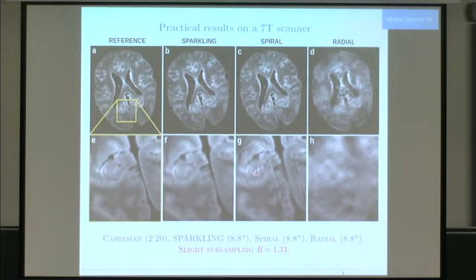And this is with a radial trajectory, that you should never use for doing anatomical MRI with high resolution. Never use radial.